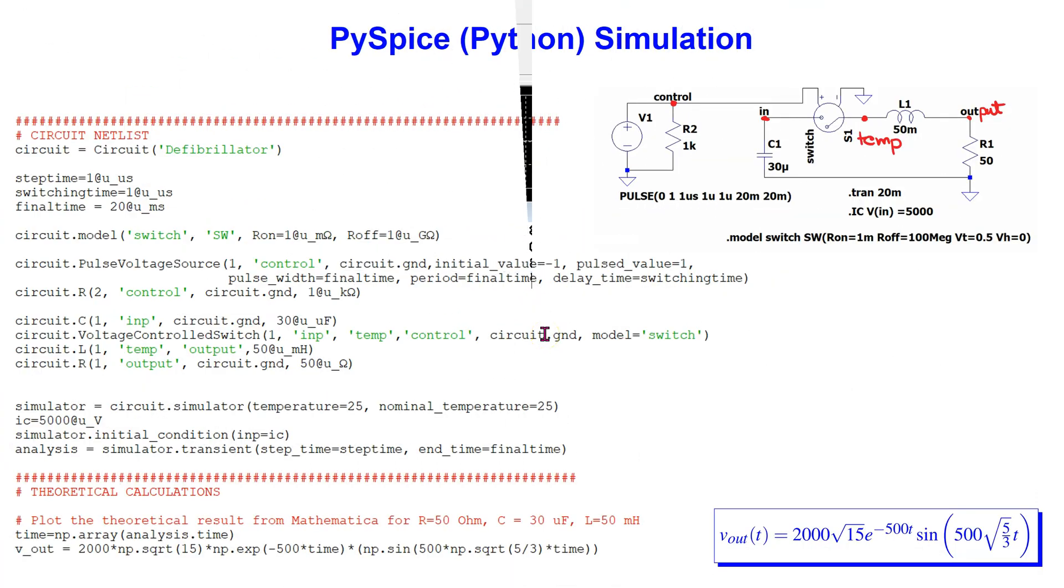Next we look at how to simulate the circuit in PySpice. We define the switch model and the pulse voltage source controlling the switch. We set the switch to close at one microsecond as before.